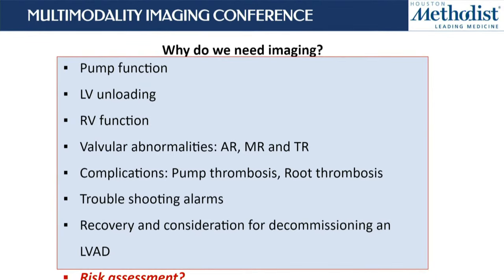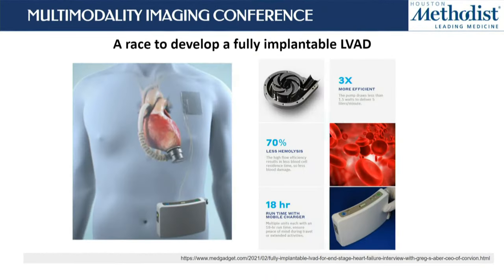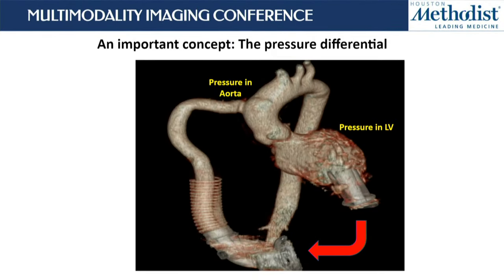And this is where we are really interested in trying to figure out which of our patients are at high risk of having strokes and other hemocompatibility-related adverse events, an area that I'm very interested in, and hopefully we'll make some developments there. There's definitely ongoing research to improve the device design. And there is a race to develop a fully implantable implant, which will hopefully happen in the next couple of years. Now, important physiological concepts is what is important in an LVAD.